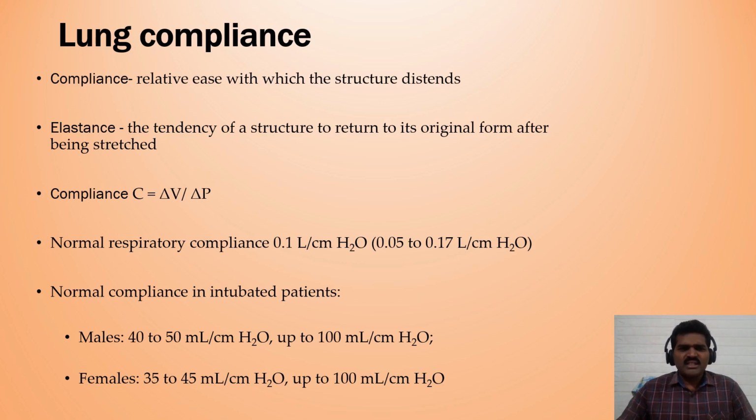Normal compliance in intubated patients, in males, is 40 to 50 ml per centimeter of water. It can be raised up to 100 ml per centimeter of water. In females, it is 35 to 45 ml per centimeter of water. It can be raised up to 100 ml per centimeter of water.